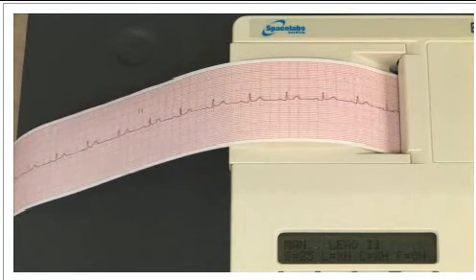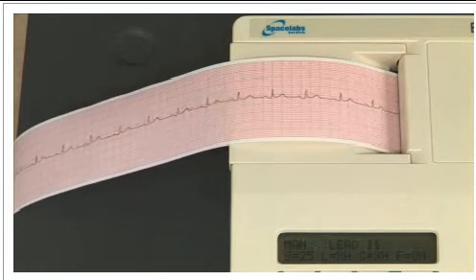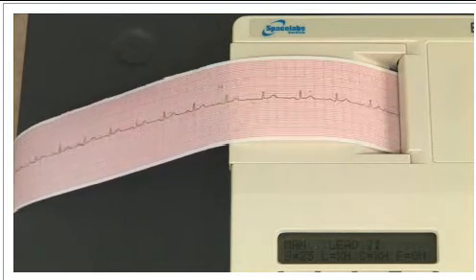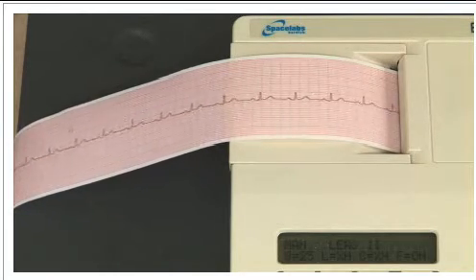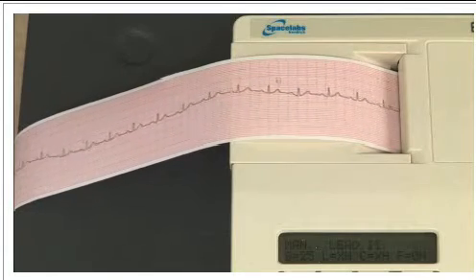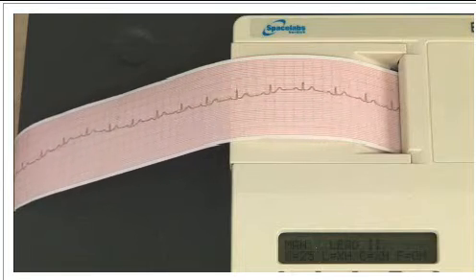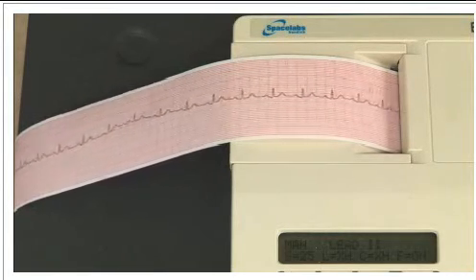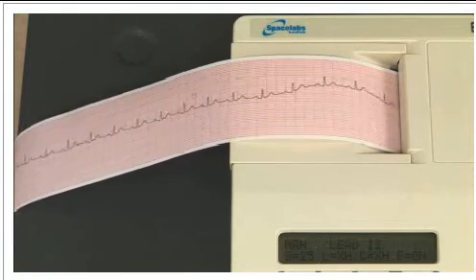It will also show how the heart rate can be calculated from the ECG trace. These recordings and heart rate calculations are similar to the data collected in the activities completed in Exercise 6, Cardiovascular Physiology. We are now measuring the ECG from the same subject who has been given sympathetic stimulation to increase the heart rate. We can now measure the heart rate in the resting state and in the sympathetically stimulated state.